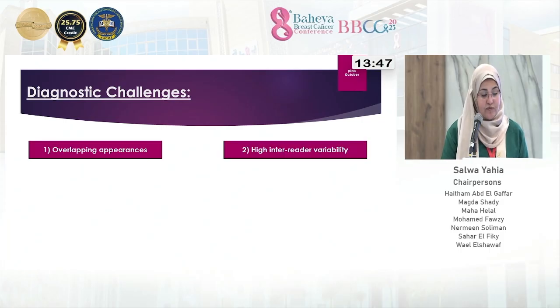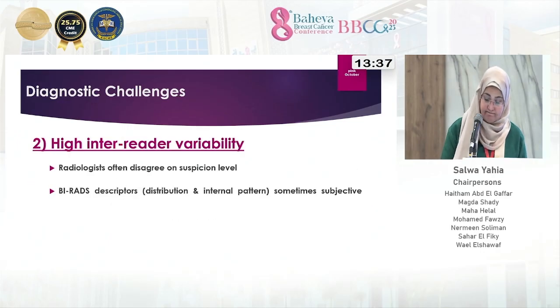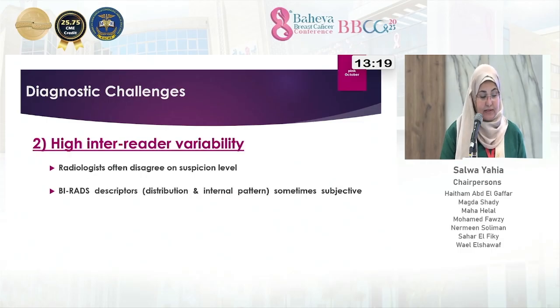Diagnostic challenges: overlapping appearance, high inter-reader variability, technical limitations, hormonal background parenchymal enhancement, and MR-only lesions. Overlapping appearances between benign, including hormonal, fibrocystic changes, mastitis, post-operative changes, versus malignant as DCIS and invasive carcinoma. Distribution and pattern can be non-specific. High inter-reader variability. Radiologists often disagree on a suspicious level. By BI-RADS descriptors, distribution and internal enhancement patterns are sometimes subjective.